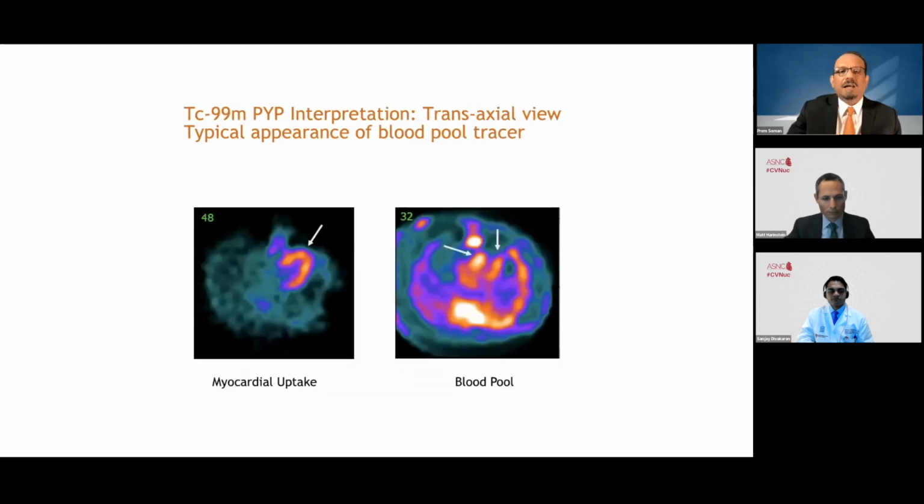Now, again, in terms of pattern recognition, if you do a chest SPECT acquisition, when we do the reconstruction, if the planar images look negative, we perform a SPECT reconstruction, which means the limits are expanded to go from the base of the neck up to the diaphragm. And we don't reorient the SPECT images to the standard cardiac short axis and long axis views.